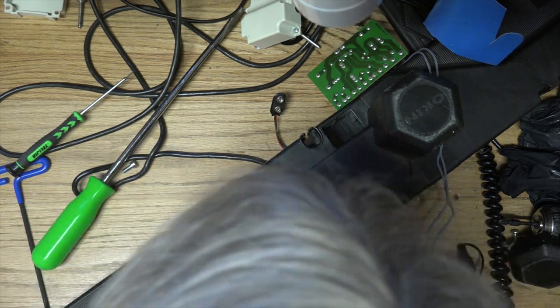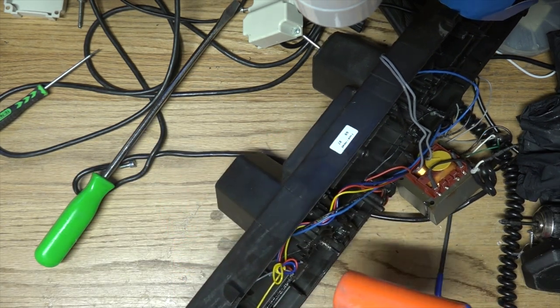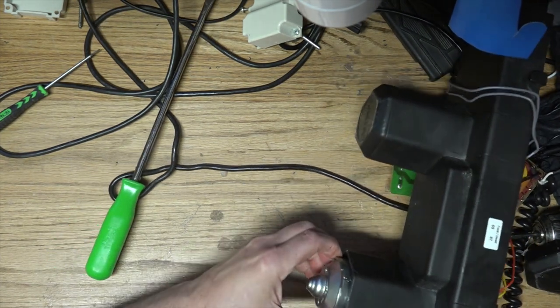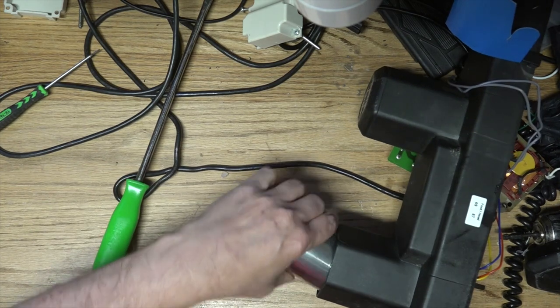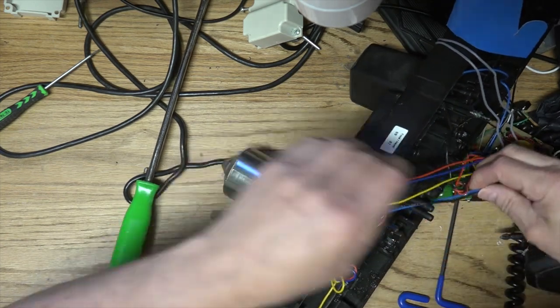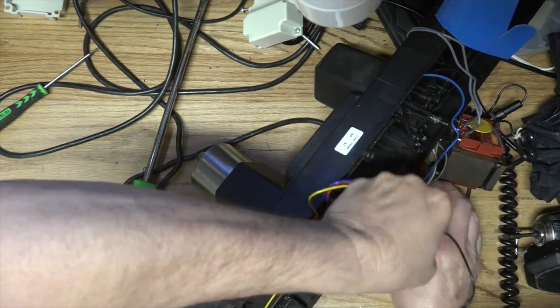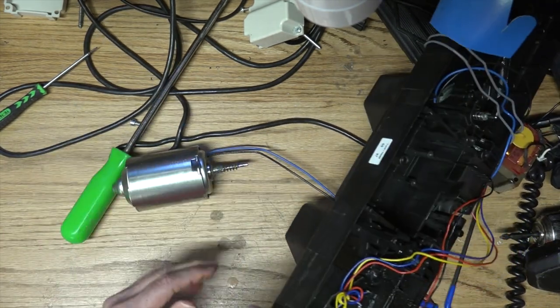And apparently that's the motor, huh? Does it just need a little persuasion? Do we need to get the acoustic calibrator out? Apparently that's what it took. So kind of press fit in there. Ooh, and it's still press fit in there. There we go, there it's coming. Oof, and of course, don't forget about the wires. Remember the wires. So we'll just unplug those from the board here. All right, and there we are. The motor is free.